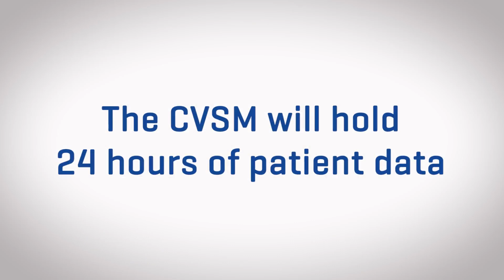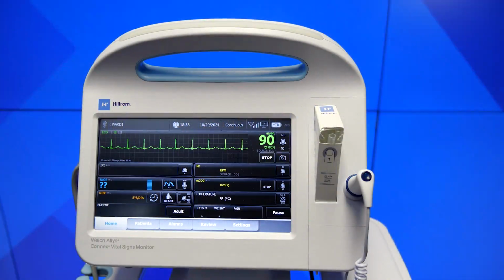from the monitor. To begin ECG monitoring, plug in the USB of the ECG module into the bottom of the device. The screen will automatically change to show an ECG tile at the top of the content area. Next, attach the 3 or 5 leads to the patient, following proper lead attachment procedures. More information on proper lead preparation and placement can be found in the Directions for Use manual.